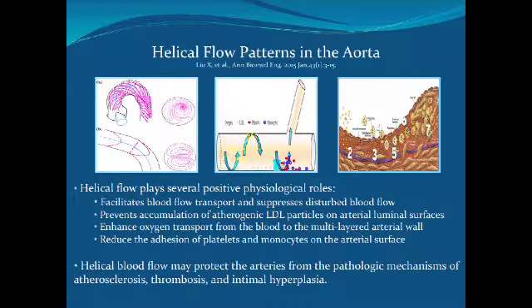So going back to that beautiful picture that I saw 10 years ago now, in preparing this talk, I wondered, well, what do people say about this helical flow? Does it really have bearing on disease? And indeed it does. It plays several positive physiologic roles. It facilitates blood flow transport and suppresses disturbed blood flow. It prevents the accumulation of all those atherogenic products because they're swirling along and they don't have time to sit there and incorporate into the vessel wall. At the same time, it's enhancing oxygen transport.